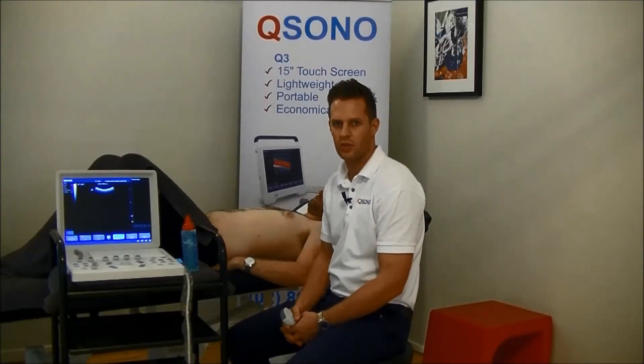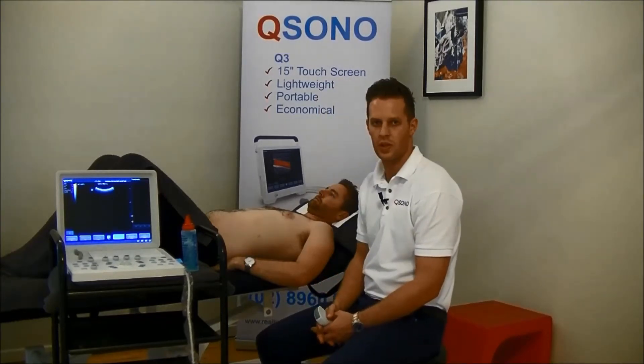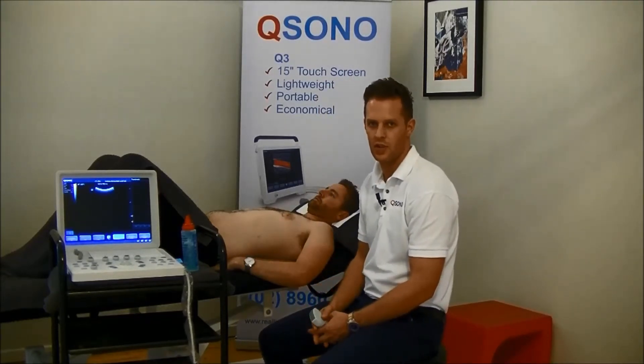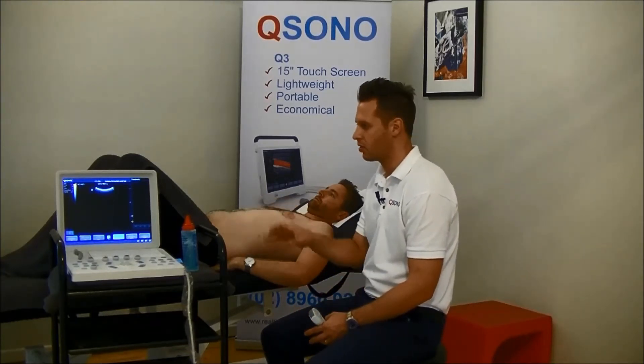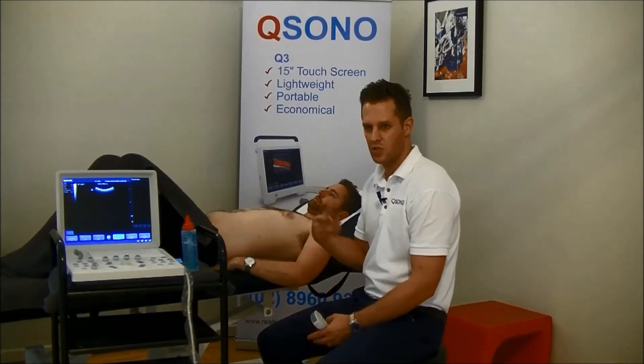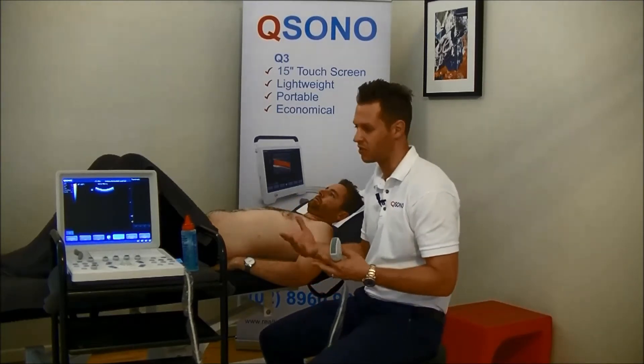Hi guys, today we're going to be having a look at the transverse abdominus using the Q-Sono Q6. We've got the patient set up here. We're going to be looking at static contractions of transverse abdominus, and then we're going to also have a look at some more functional positions and see how you can use real-time ultrasound to measure transverse abdominus and internal oblique function while the patient's doing some functional activities.